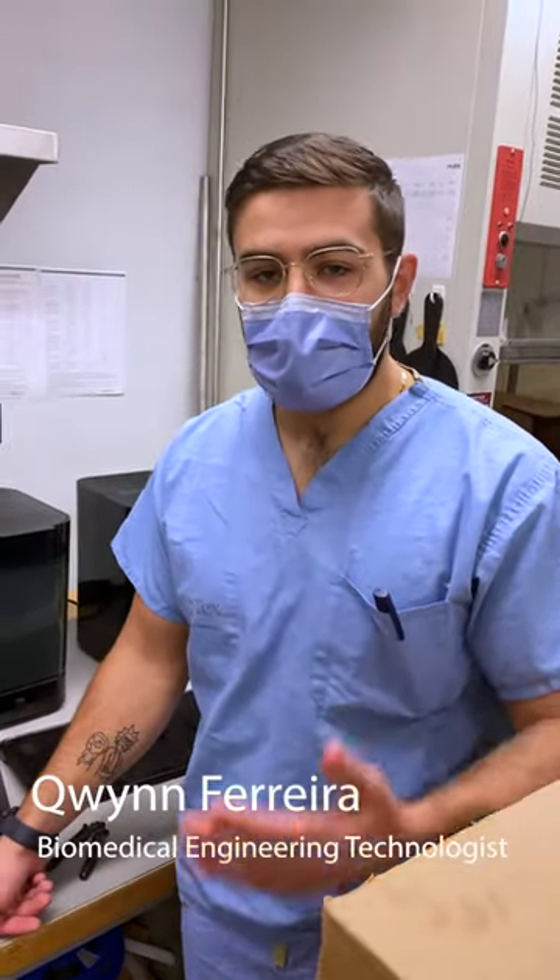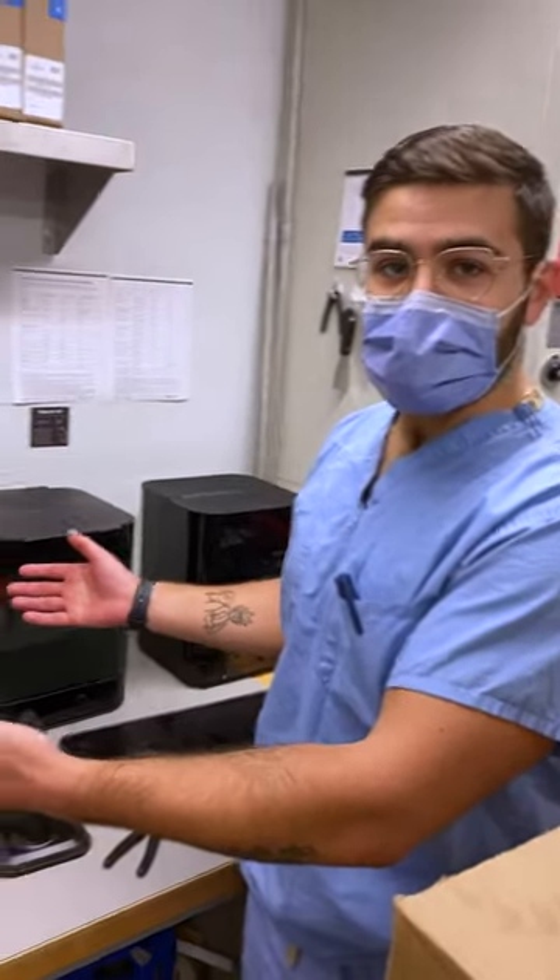Hi, my name is Quint Ferrer. I'm a biomedical engineering technologist here at Sinai Health, and in front of me I have some 3D printers.